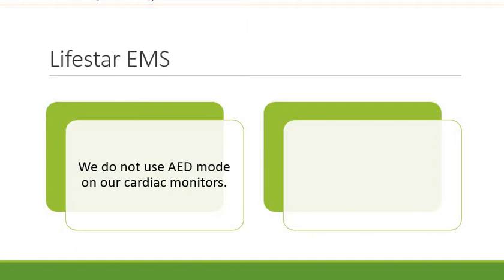First, the overwhelming majority of our ambulances are staffed by paramedics and AED mode would not be necessary. The second reason is because it takes time to take a cardiac monitor out of AED mode. If the patient's already on the monitor and we've already recognized the rhythm and made a shock or no shock decision, we don't want to delay providing that definitive shock to the patient by having to push more buttons and take the cardiac monitor out of AED mode.